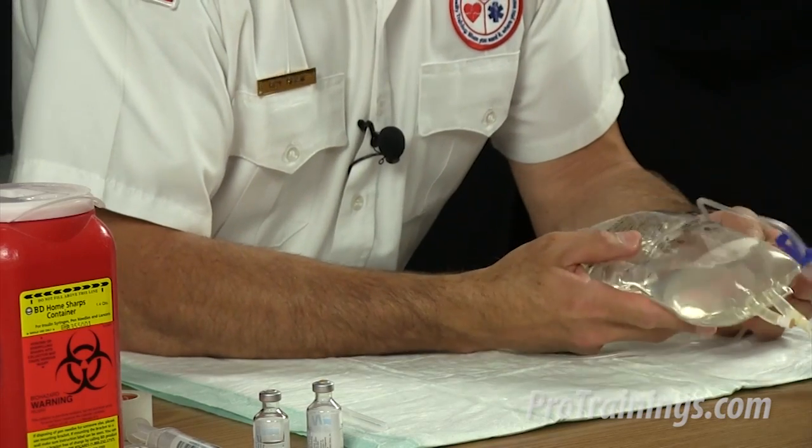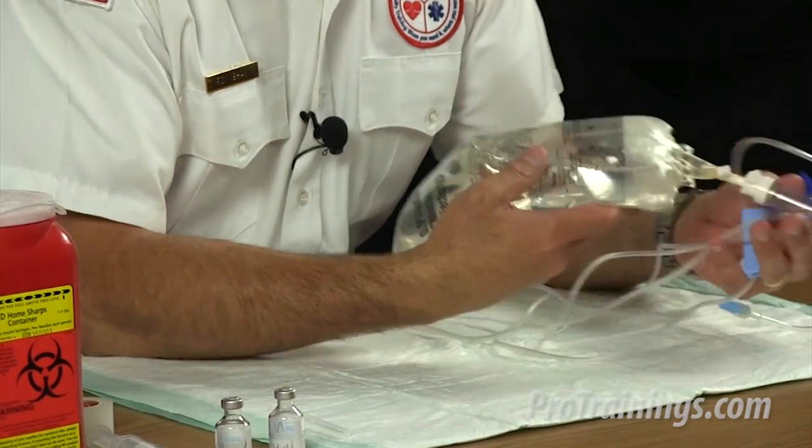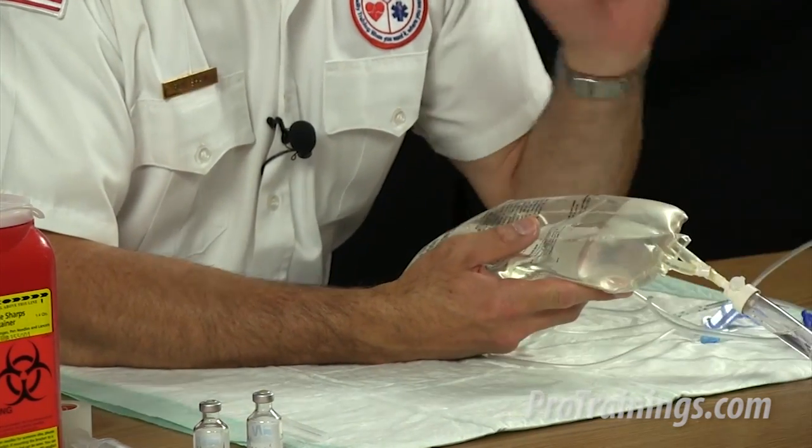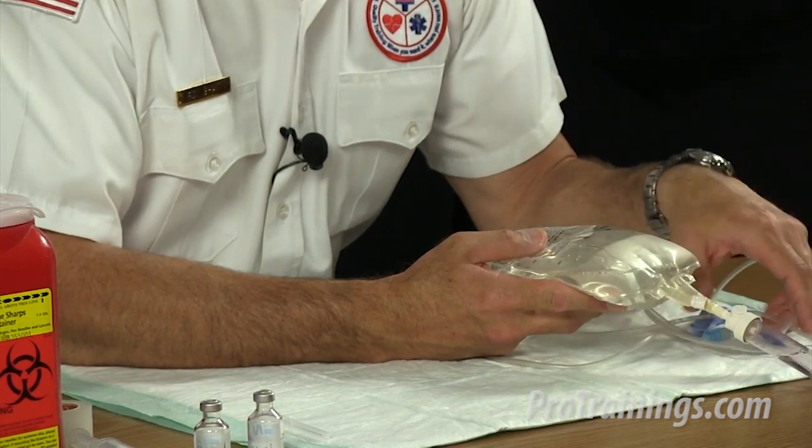Use fluid infusion and administration sets, IV, intravenous bags, tubing, and connections for only one patient, and then dispose of these appropriately after their use.